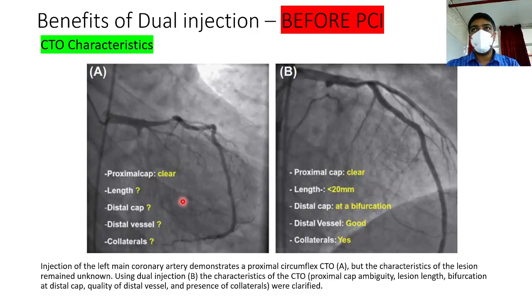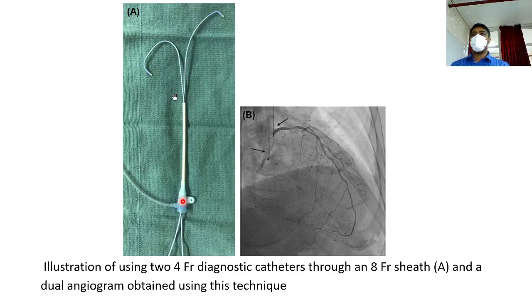Actually, if you are proceeding with an angioplasty, you have to take a larger French catheter. This is before the CTO decision, where we are doing only the angio. We have not decided whether to do the CTO or not. But for planning how to assess the lesion, we can even do it with a single access site and do a dual injection. If you are planning a CTO, or if you are concerned about CTO in future, you have to take the angio in such a way that all the information is available for the CTO. Maybe for that we do it like this.